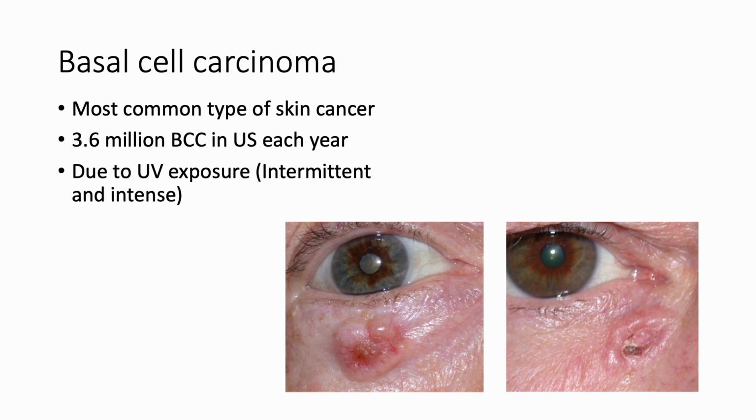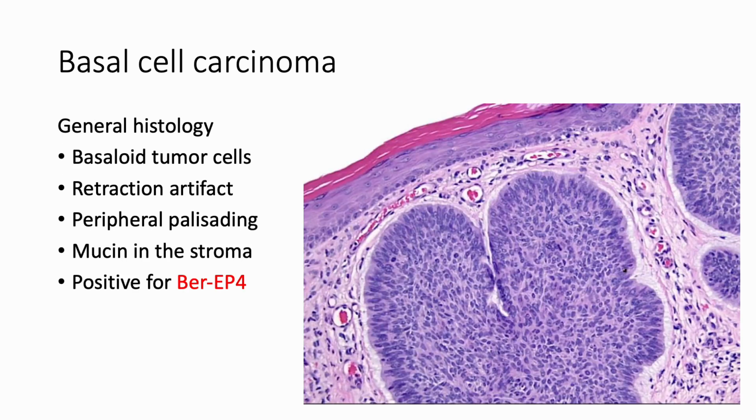And the risk factor for basal cell carcinoma is also UV exposure. So then you understand it is more common in light skin colored people. And here is the histology.